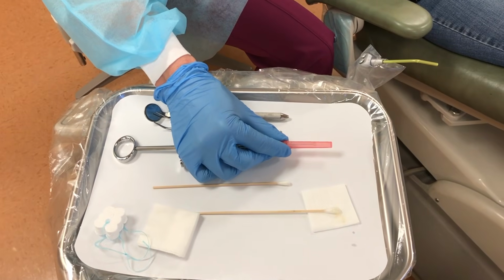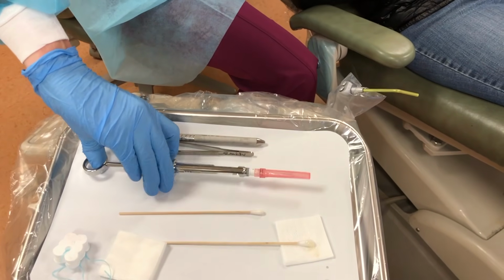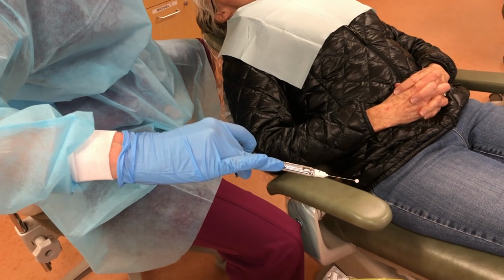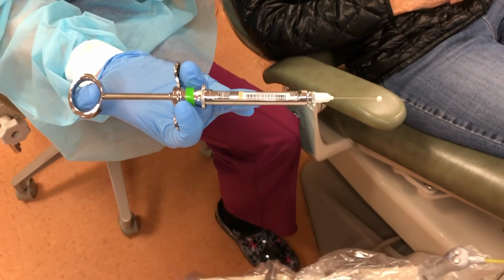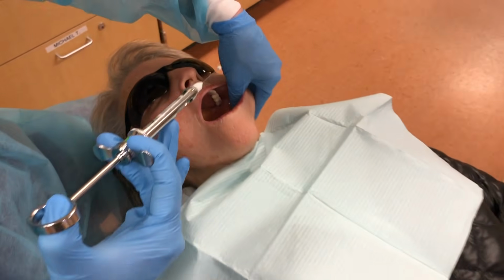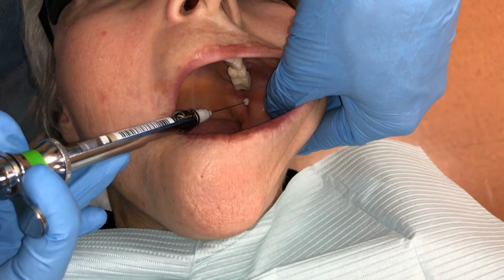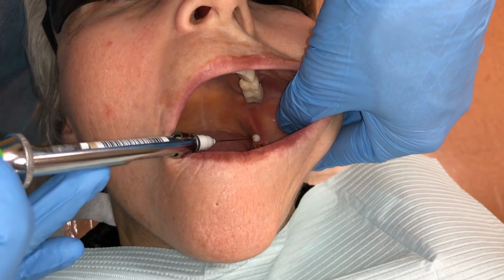The anatomy of a patient's ramus can vary widely, including the flare and the position of the lingula. Once the clinician has determined the appropriate retraction and identifies bevel and window placement as well as stability of the syringe, the penetration angle will be over the contralateral premolars at the commissure, at 2 to 3 millimeters above the greatest concavity of the coronoid notch.